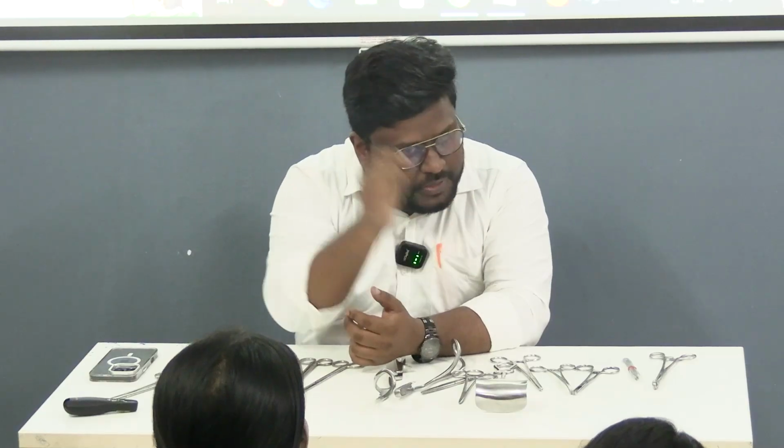হ্যাঁ, ওটাই আমি এতক্ষণ বললাম, তুই শুনিস নি। Currently we also use absorbable sutures on the skin. আমরা এই যে যেটা দেখালাম, this is a little old technique. এটাকে বলা হয় ম্যাট্রেস সুচারিং। ম্যাট্রেস, খাটের গদি হয় ম্যাট্রেস, ওই ম্যাট্রেস সুচার বলা হয় এটাকে। This leaves scars, it leaves big scars. একটা ইনসিশনের আমরা ওপর নিচে দু জায়গা থেকে সুচার পাস করলাম, আবার পাস করলাম, it's going to leave long scars.